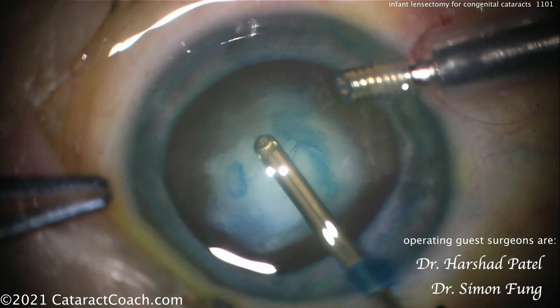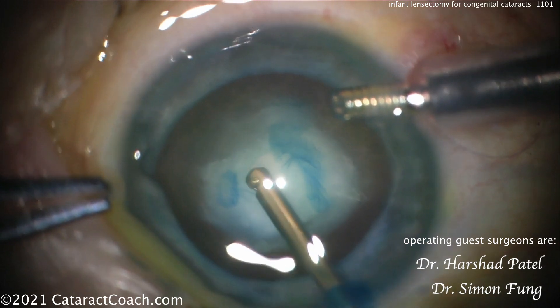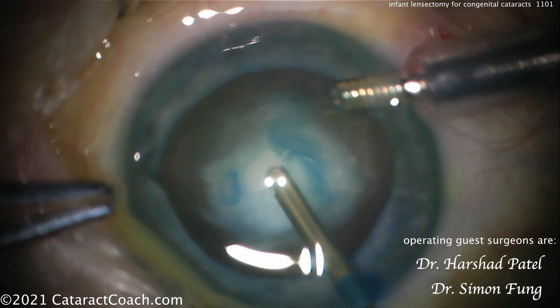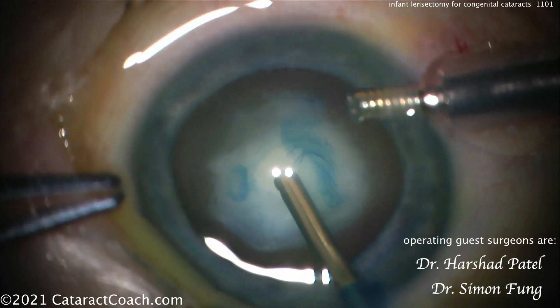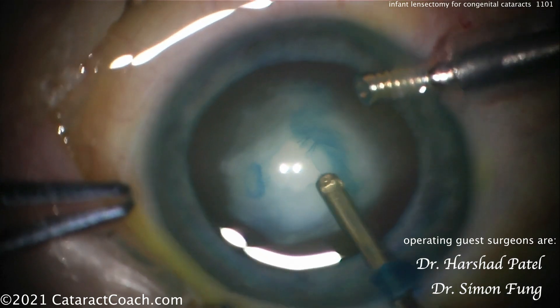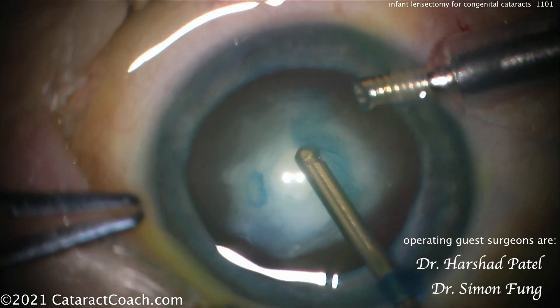Very important to save capsular tissue here — we need to have a good area of support for placement of a future IOL. There's another technique from Ken Nishal, the two-incision push-pull technique, which is simply making two small incisions in the lens capsule like an equal sign, then grabbing one and pushing it and grabbing the other one and pulling it toward you. That tends to open up into a very reasonable, pretty round capsule opening due to the elasticity.